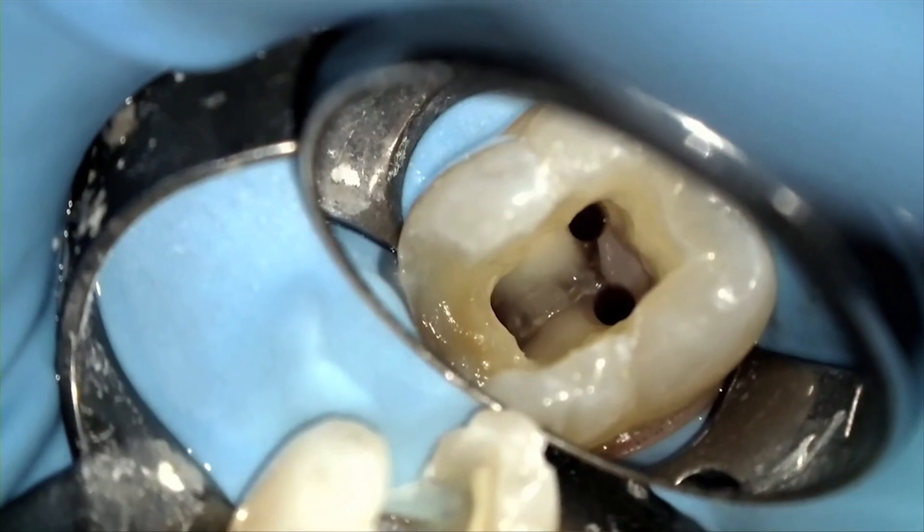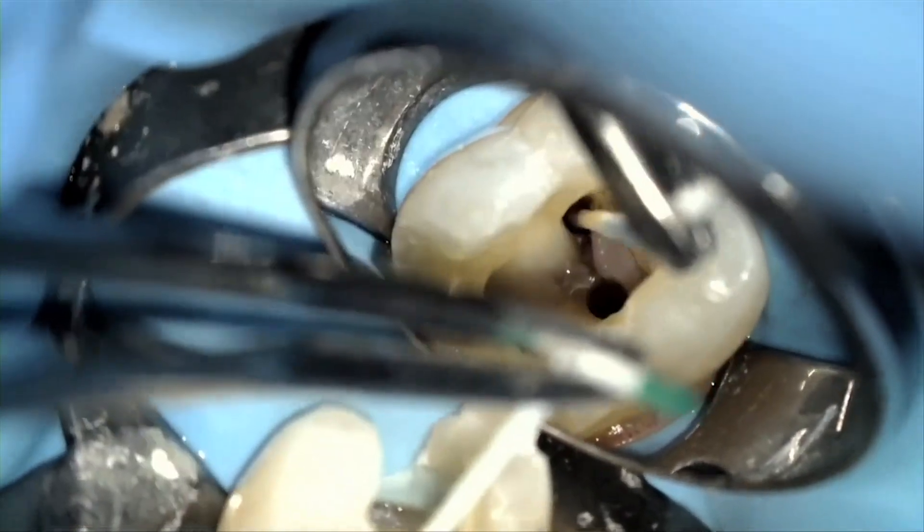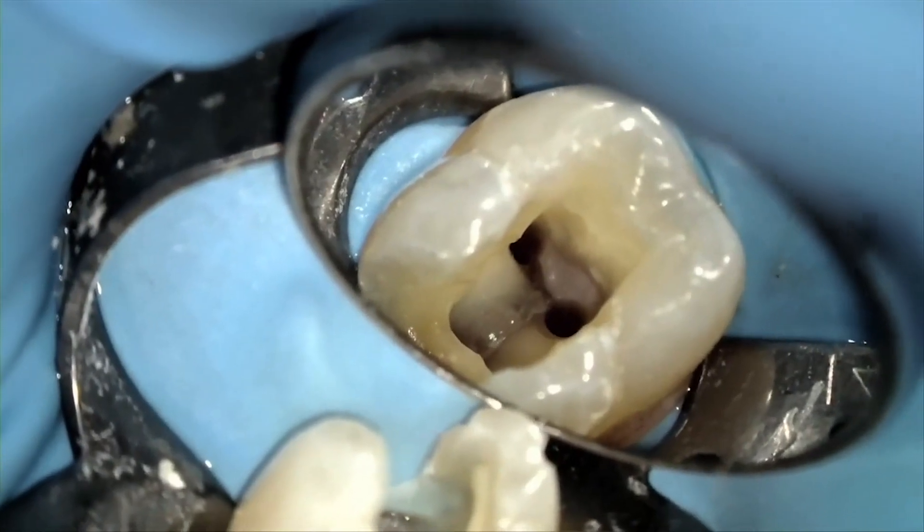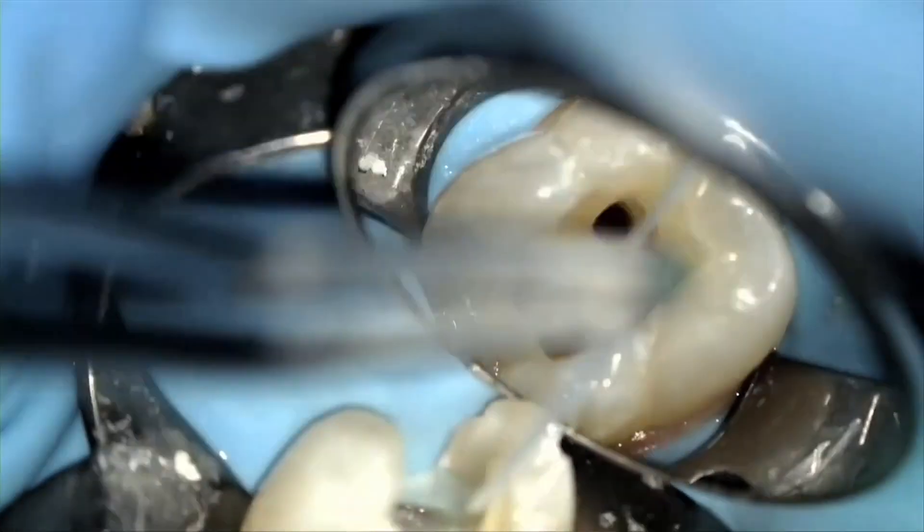At this point, you've instrumented, medicated, irrigated, and dried the canals, which means you're now ready to obturate. When it comes to selecting an obturation system that is ideal and suitable for you and easy to perform, it comes down to the following: if you can place a paper point in a canal without touching the pulp chamber walls, as you do when drying canals, the Gutta Core is the warm obturation system for you.